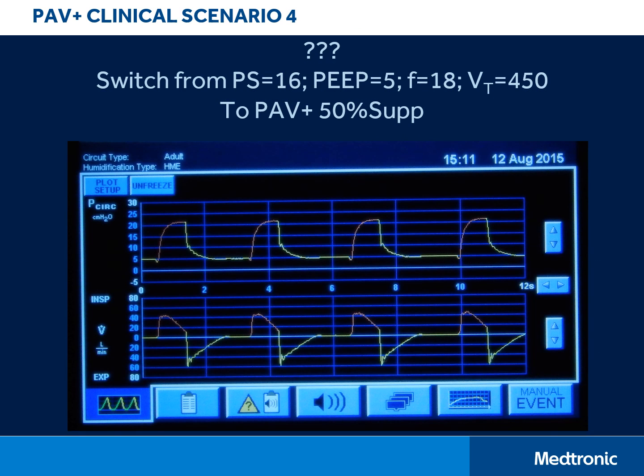This next scenario depicts a patient that seems to be tolerating pressure support very well and looks extremely comfortable with good tidal volume and respiratory rate. Typically, we would have no idea that there may be a hidden underlying issue that has the potential to significantly prolong this patient's length of stay.